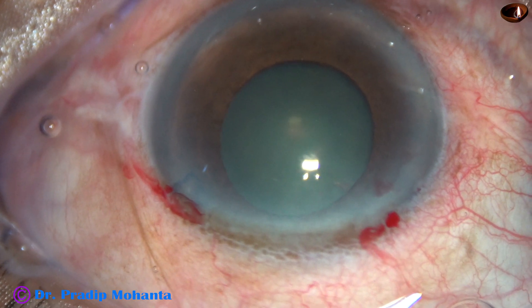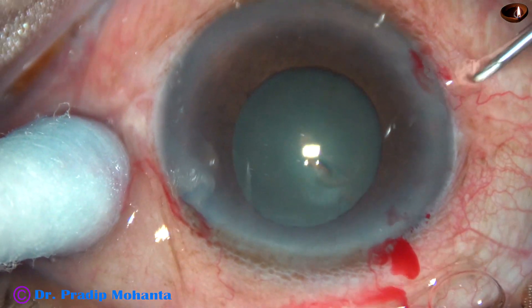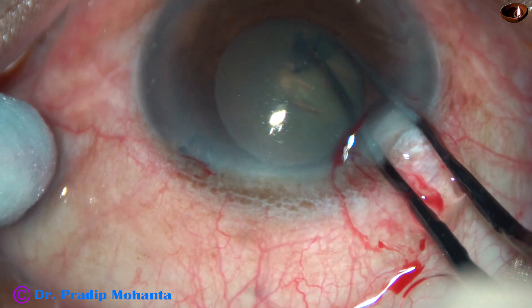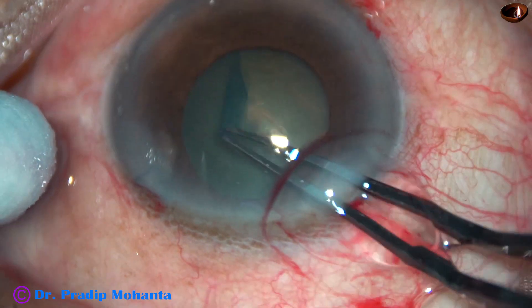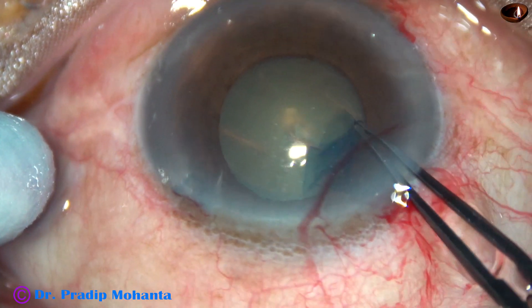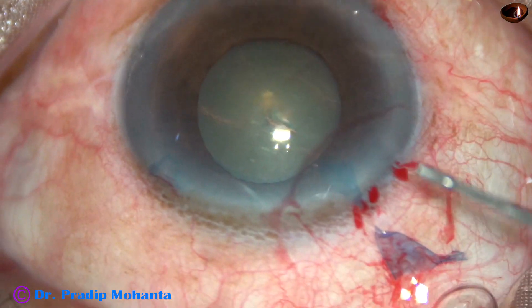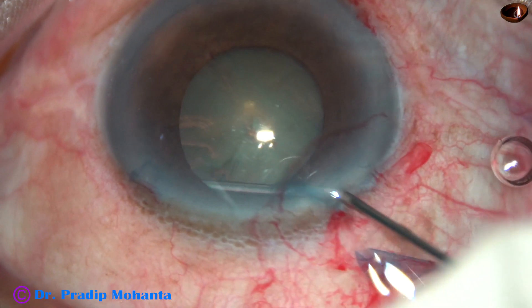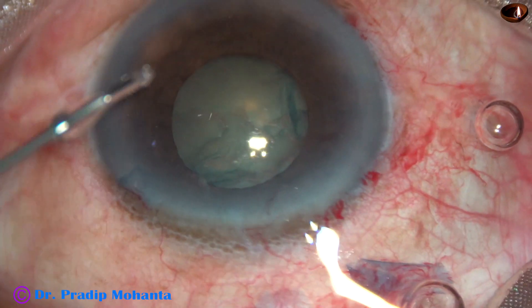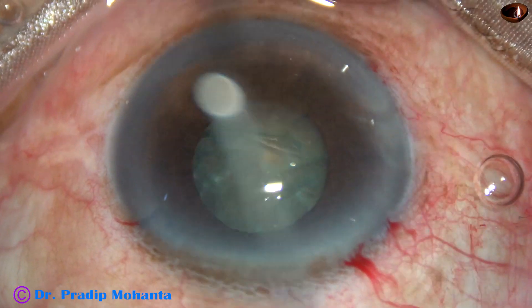I thought I'd be able to do the case without any pupil expansion device, so I proceed with rhexis. The size of the pupil is about 5 millimeters at this time, so I'm doing the rhexis along the margin of the pupil. But as the capsule touches the iris, it tends to become small. After hydrodissection, as I touch the iris at some points, the pupil becomes more small.